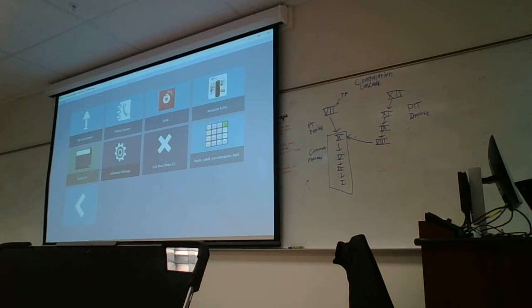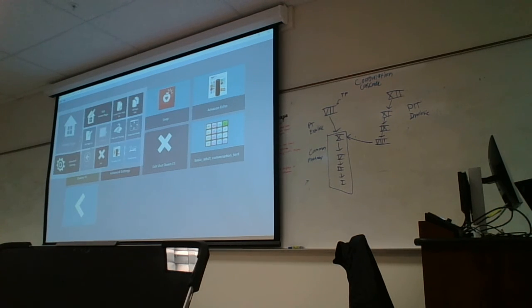And then I'll show you also within here. So Matt, just to clarify, is Communicator 5 then the basic communication software of Tobii Dynavox, and is SnapCore within Communicator 5 or is SnapCore separate? They're two separate communication programs. Okay, maybe clarify that.